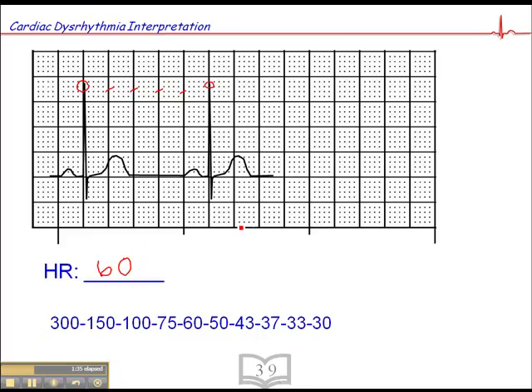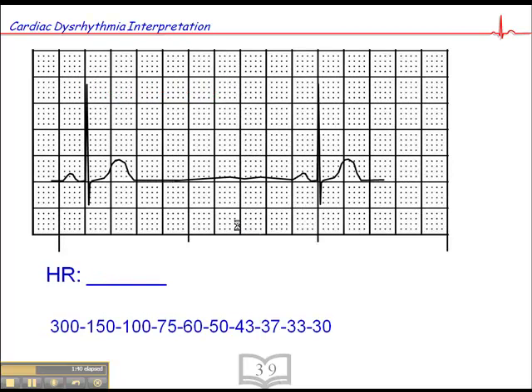You can pause this at any time if you want to redo the calculation yourself to be sure. Here's another one — this looks like a bradyarrhythmia. A QRS falls pretty close to the dark line, and counting forward: 300, 150, 100, 75, 60, 50, 43, 37, 33. That's a pretty slow sinus bradycardia.